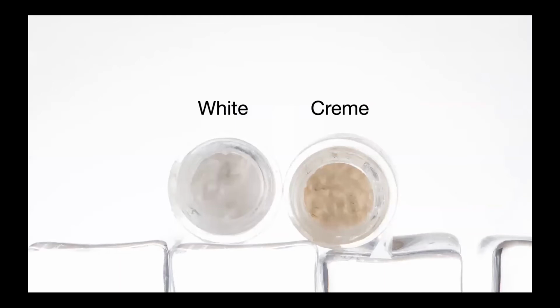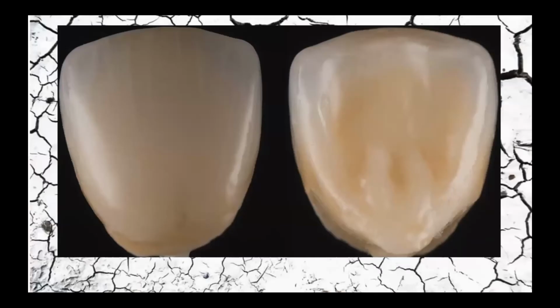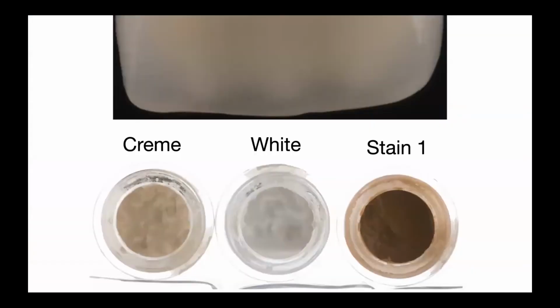And very important are bright stains like white and cream. Of course, this is a necessary component to emphasize cusp tips or mamelons. Our restoration will be more aesthetic when we use these stains. At the same time, we can emphasize ridges and cingulum on the labial or palatal side of front teeth, or we can paint cracks if there's such a necessity, or create other kinds of contrasts.